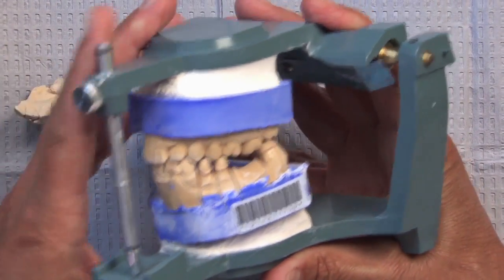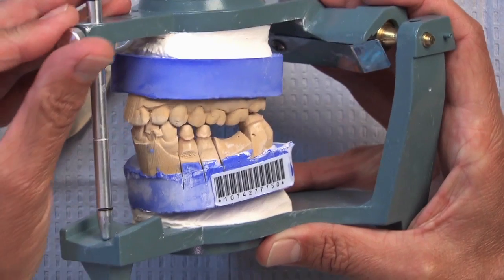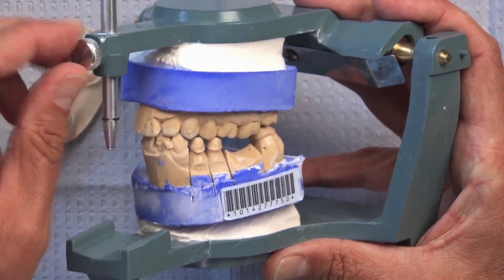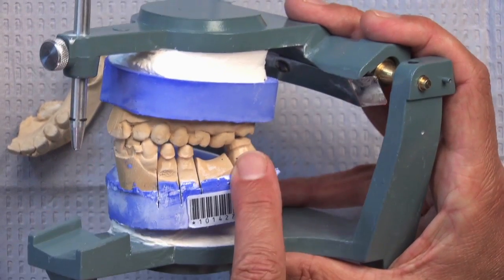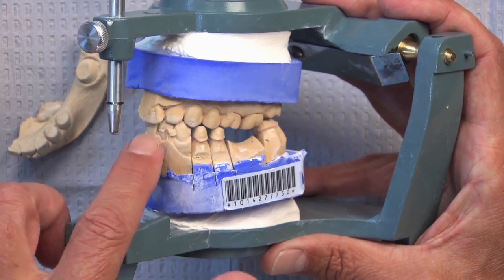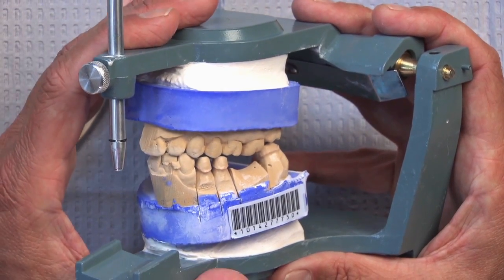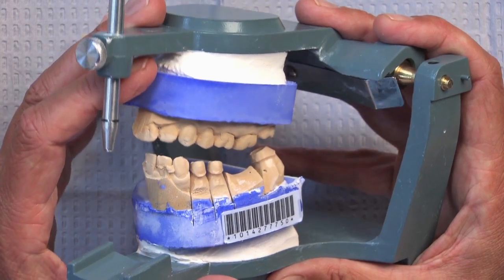I'm going to raise the pin because I want to see if we can see something that we often see when we are doing a larger case like this on a quadrant impression tray. Really all we have contacting here, with a bridge going from this wisdom tooth all the way to the first bi, are these anterior teeth. And often when it's mounted like this, all you have to do is squeeze it, and you can see the shift right over there as it closes.